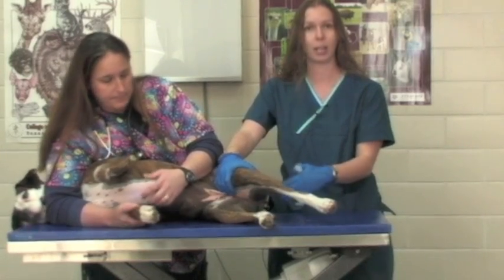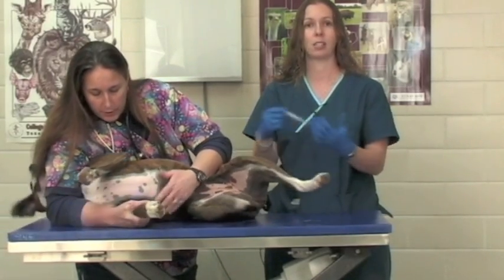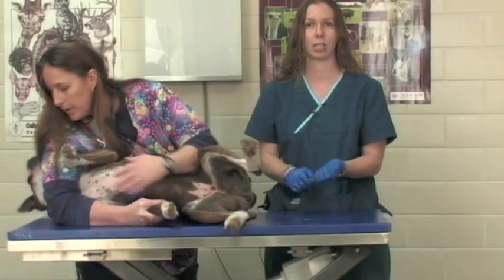But the most practical way, if you need a sterile sample, is to introduce a needle into the patient's bladder, get a sterile sample, and then submit your sterile sample to your testing facility.